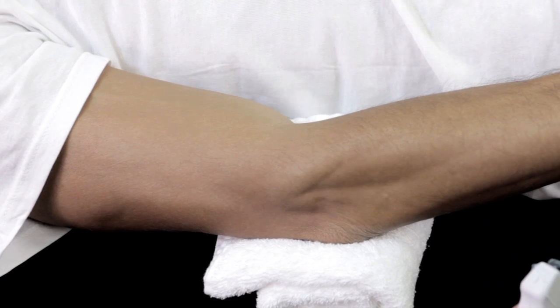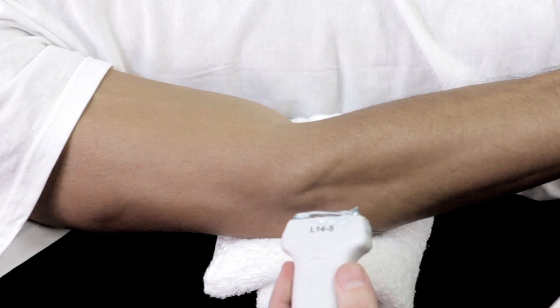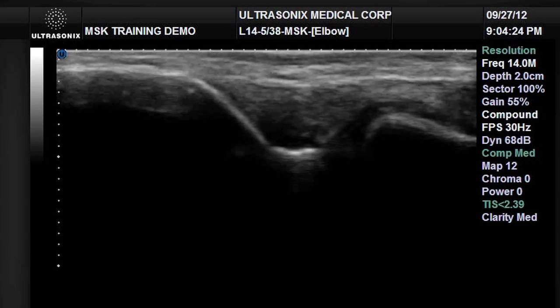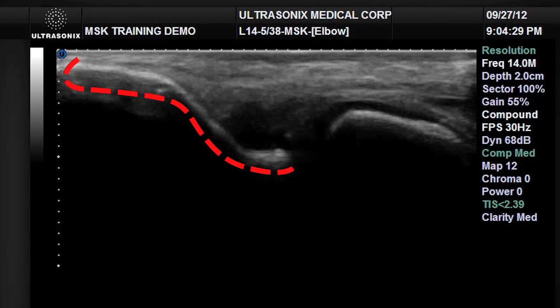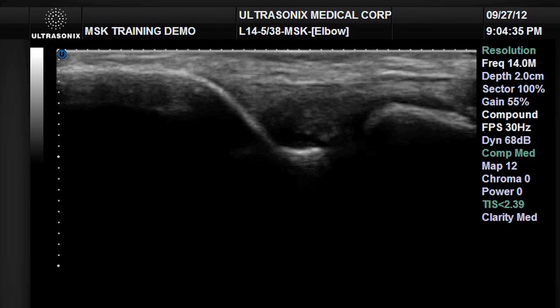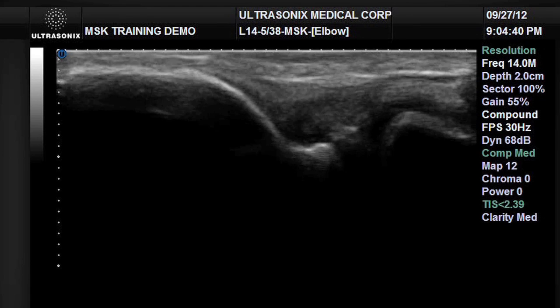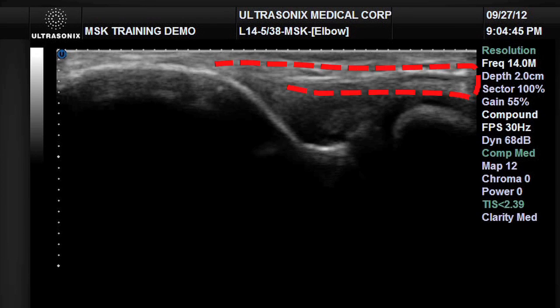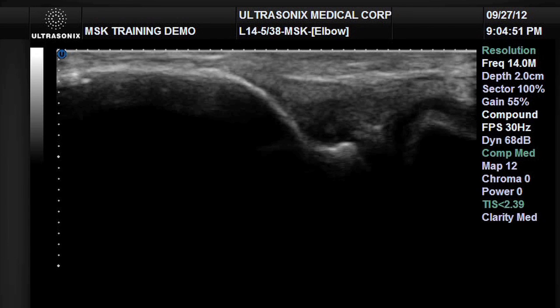Probe placement for the lateral epicondyle image is longitudinal or long axis, coming in a direct lateral to medial scan plane. We visualize the bony landmarks of the slope of the lateral epicondyle of the humerus on the left, and the flattened convexity of the radial head on the right. Pronation and supination maneuvers help visualize the radial head clearly. The common extensor tendon is seen spanning the joint space and extending to its attachment along the lateral epicondyle on the left.